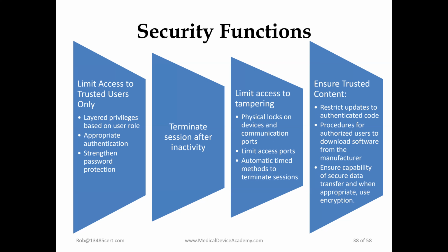And just ensuring that the content is trusted, and restricting updates and using encryption when storing and transmitting data. You can strengthen your password protection by avoiding hard-coded passwords or common words, and just limit public access to passwords. Don't have a password on a sticky note on the device or whatever that may be. And hard-coded passwords are less than ideal, so if you can avoid that, they recommend it.